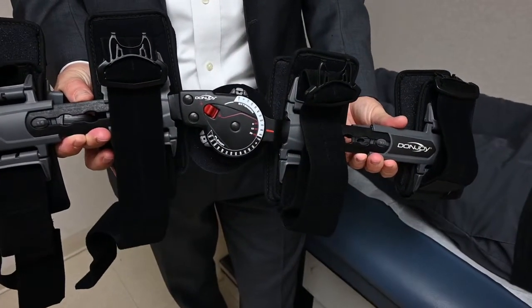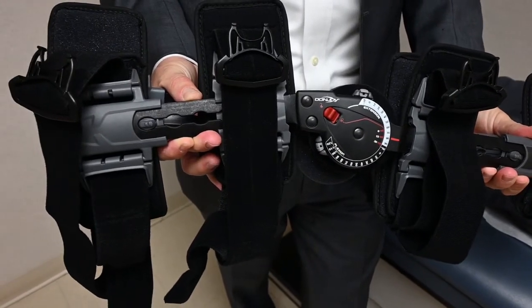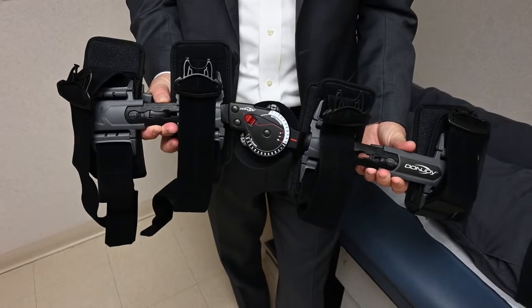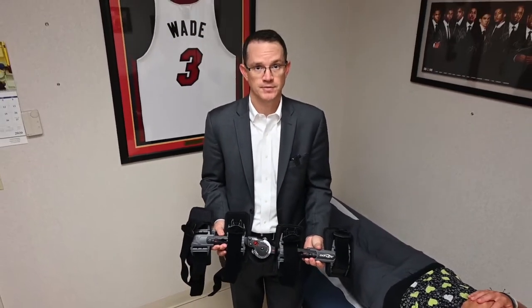The post-operative hinge knee brace is designed to hold the knee out straight and lock it in extension when you're ambulating. However, it also has the ability to be unlocked so that you can bend the knee at different points during your rehabilitation.